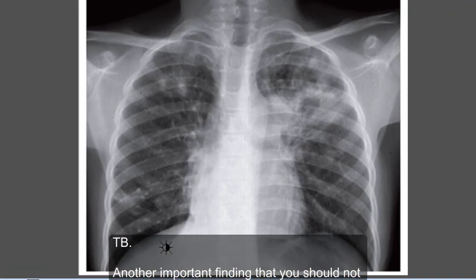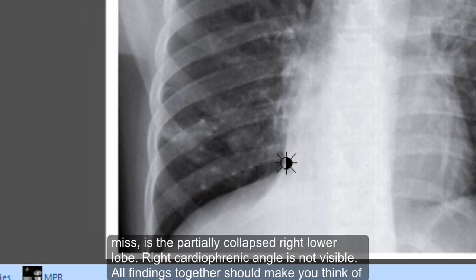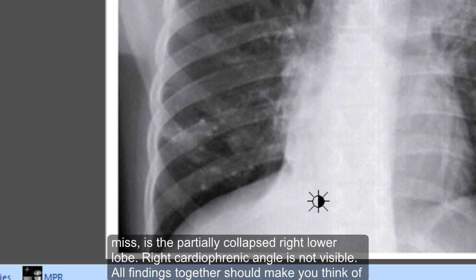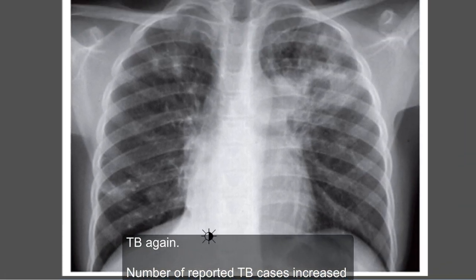All findings together should make you think of TB. Another finding that you should not miss is the partially collapsed right lower lobe — the right cardiophrenic angle is not visible. All findings together should make you think of TB.